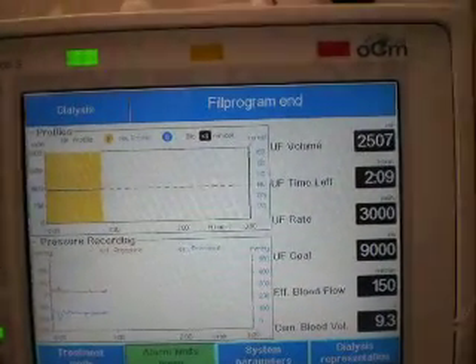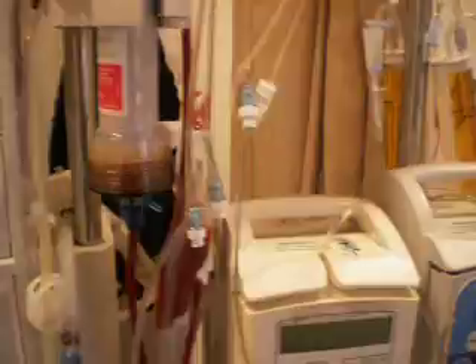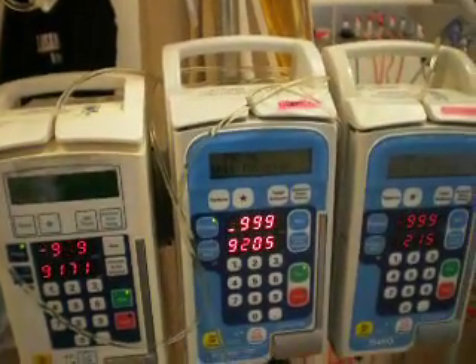So the rate of ultrafiltration is about the same as what is going back to the patient.